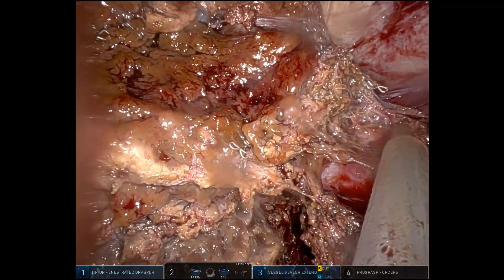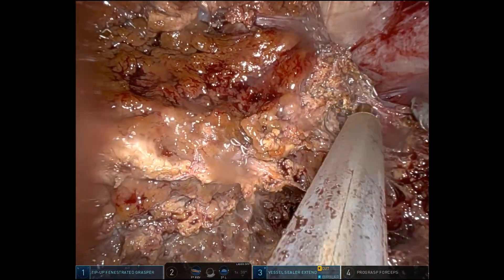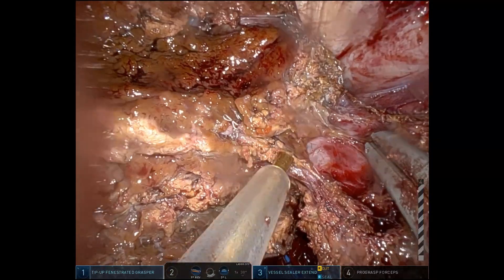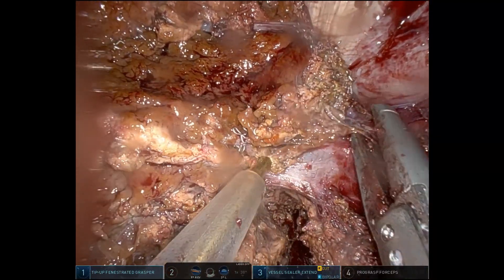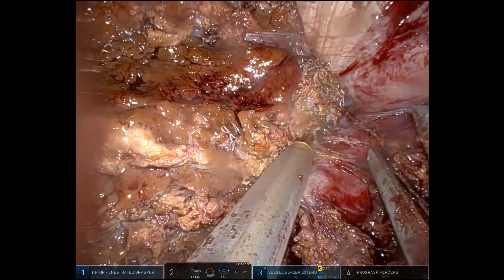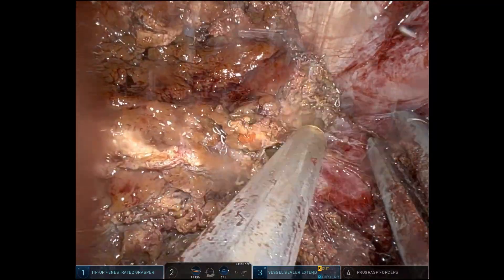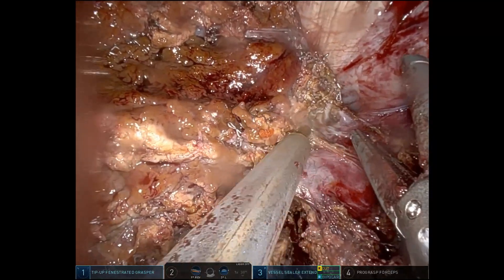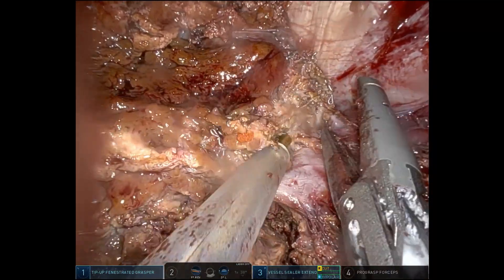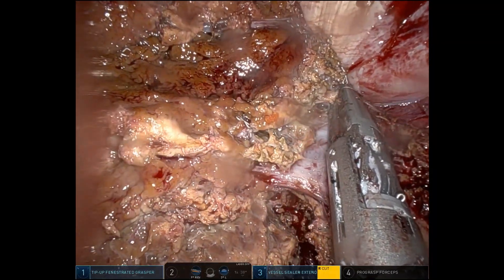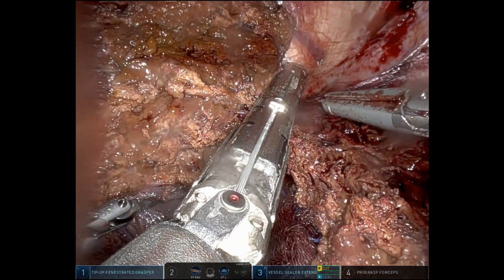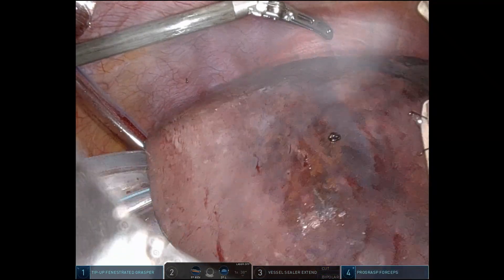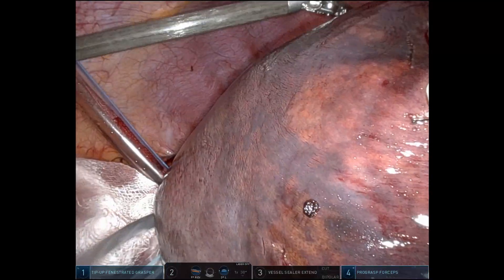There's very little tissue left — you'll see the right hepatic vein very clearly here in a moment. The CUSA is a wonderful instrument for liver surgery. You'll see that we can use this instrument directly on the right hepatic vein without causing any type of injury, as long as you have the appropriate settings and know what you're doing. So you can see this is the right hepatic vein, and we're going to divide that with a stapler. Place the specimen in a bag — traction sutures help for that too. This is removed through a Pfannenstiel incision.